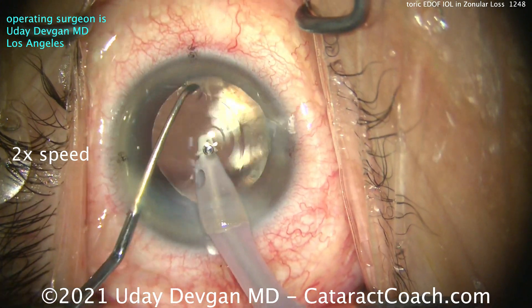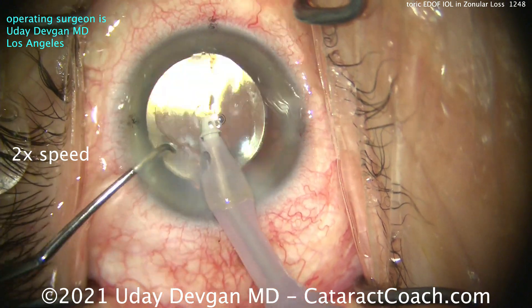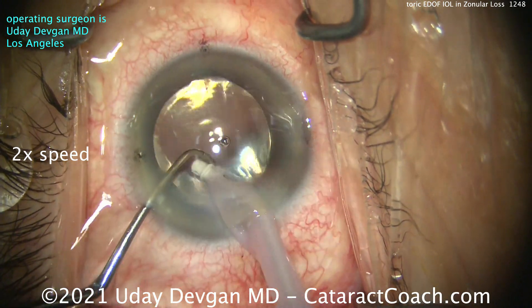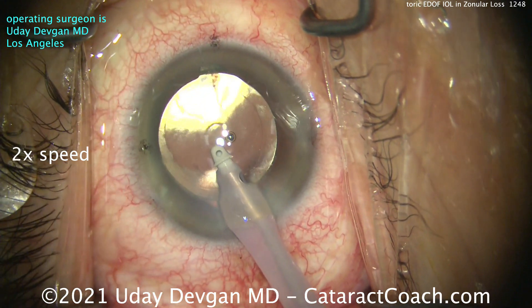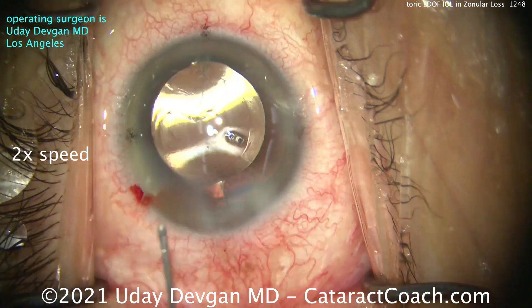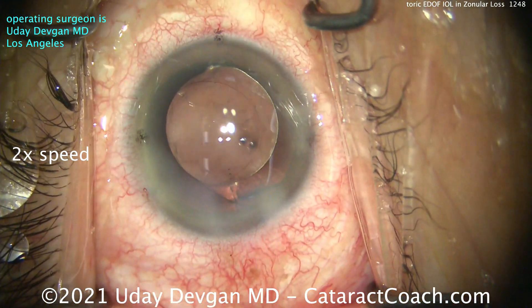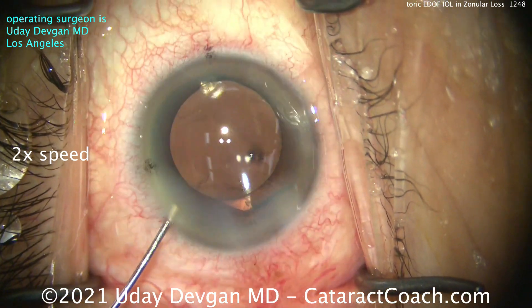I need to get that lens centered up a little more. There are the toric marks — that looks good. Not only the toric marks lined up, I need to have that central beam-shaping element lined up with those central Purkinje images. There's still a little fluffy material that needs to be aspirated out. There's still some viscoelastic in the eye. Let's seal things up — we can always do some washout using the paracentesis ports. Two paras now. Taking our time, hydrate those wounds up.